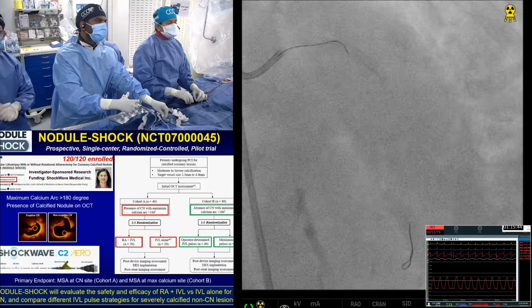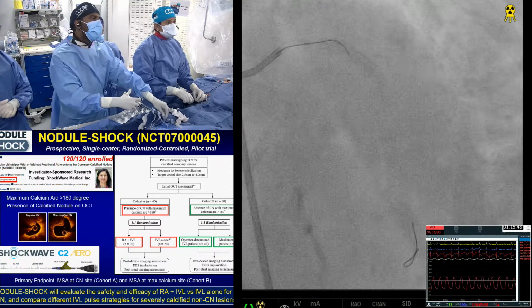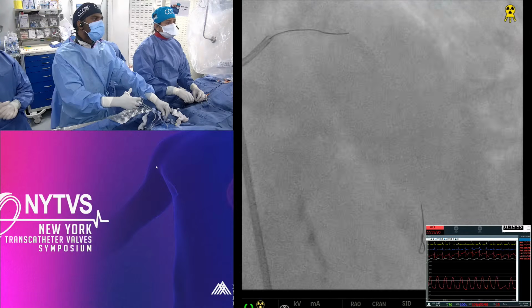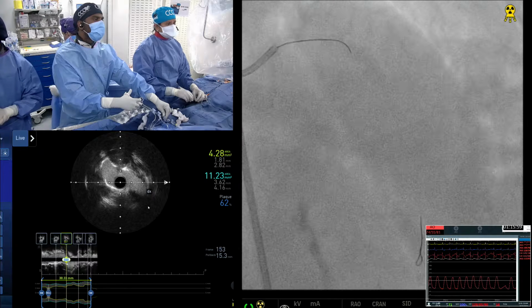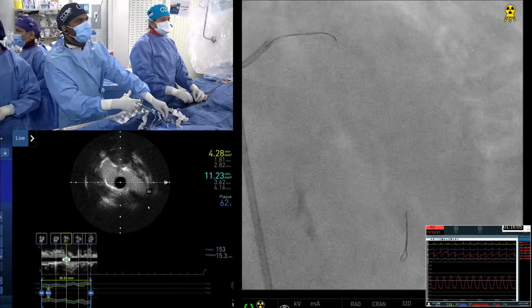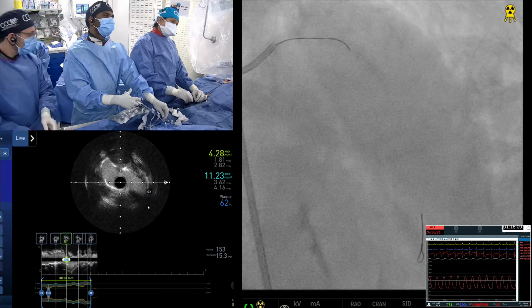You should start your lecture, SS. It's already like the end of the case. So basically, what we are going to do is go through how to image. Dr. Keen is going to retrieve that diagonal branch which is causing EKG changes. Now, can we find out if the patient is having chest pain also?